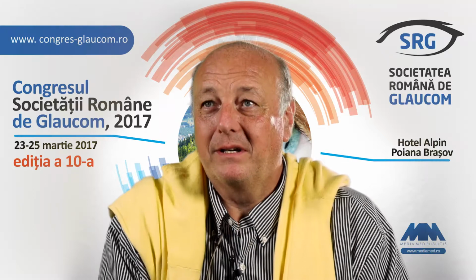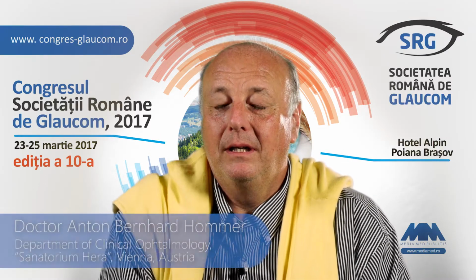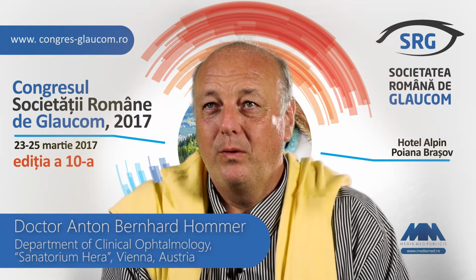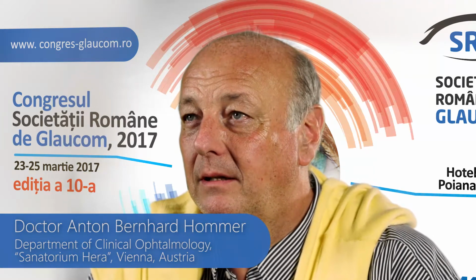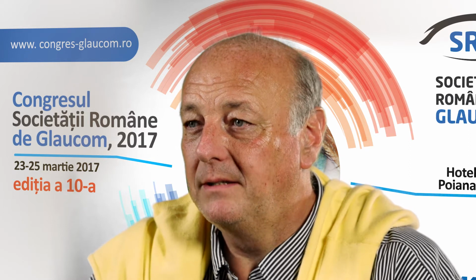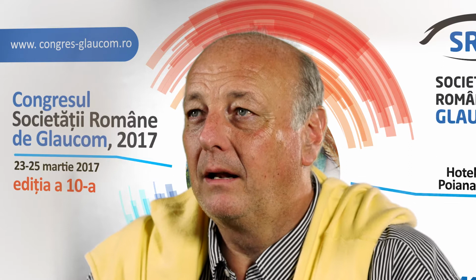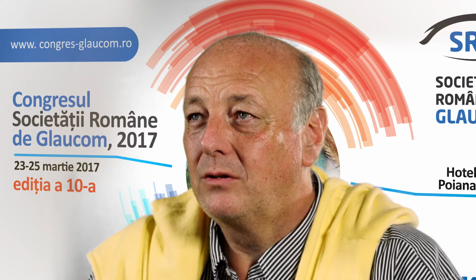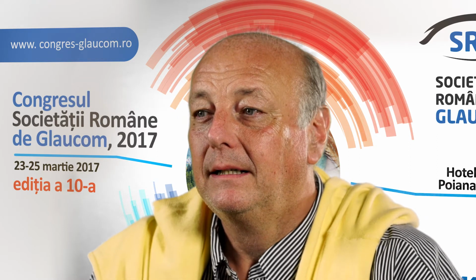I gave 3 presentations, and the first presentation was about the importance of gonioscopy. Gonioscopy is an examination where you evaluate the configuration and appearance and possible changes in the chamber angle. You need this examination for differentiation if you have open-angle glaucoma or angle closure. It's an examination which is not so frequently done as it should be, actually.